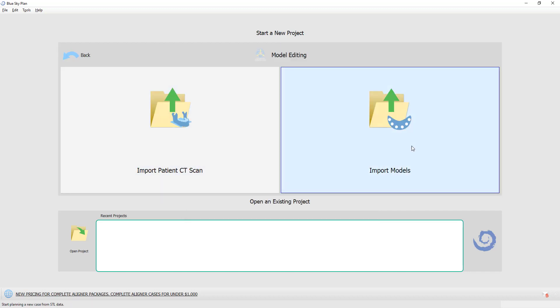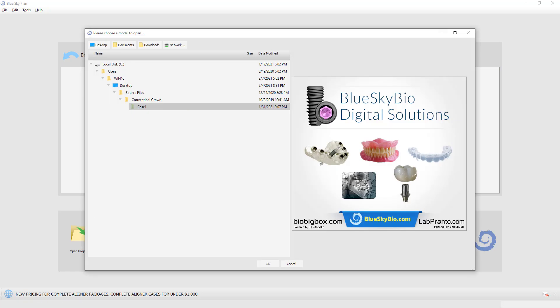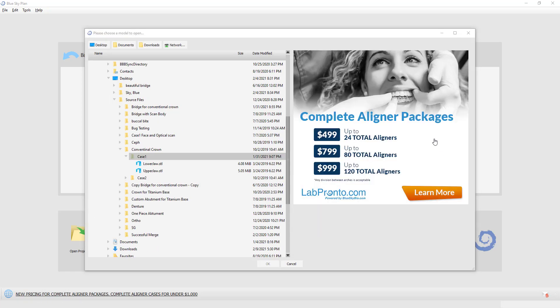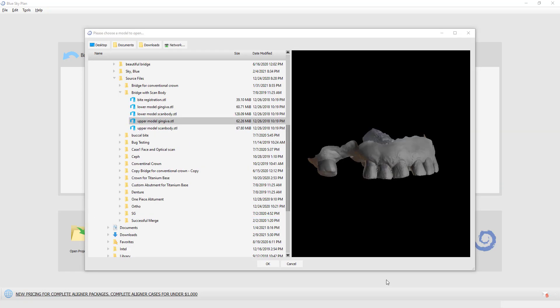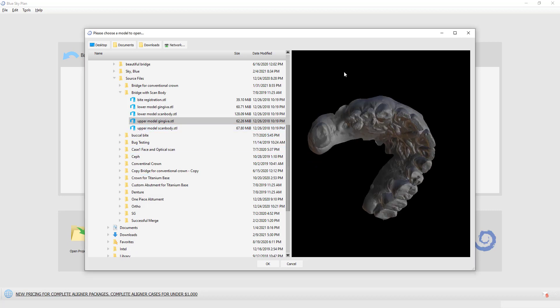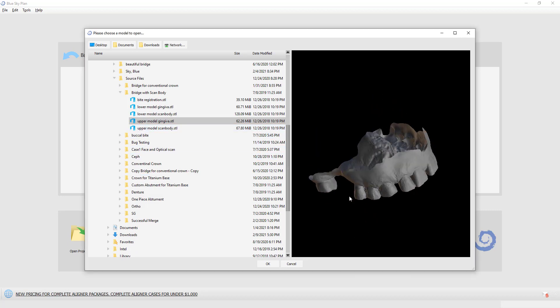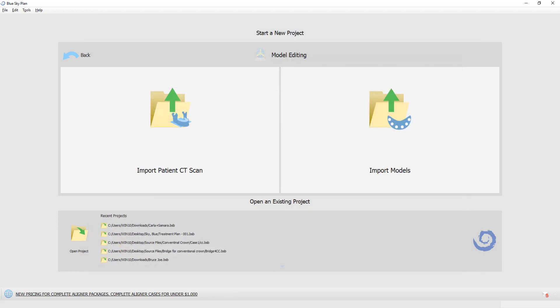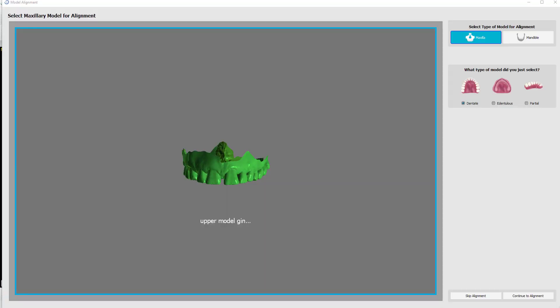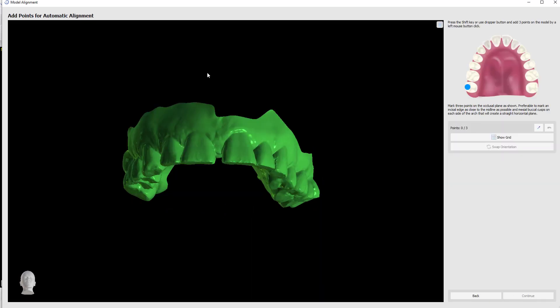I'm going to go into model editing, import models. Here's the ad for the aligner package that I mentioned earlier. I'll go ahead and navigate to a model that I have here on the computer and click OK. This model looks like it's aligned correctly automatically. But anyway, maxilla, dentate, continue to alignment.